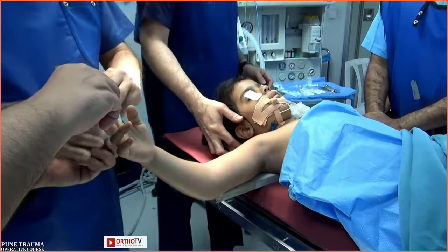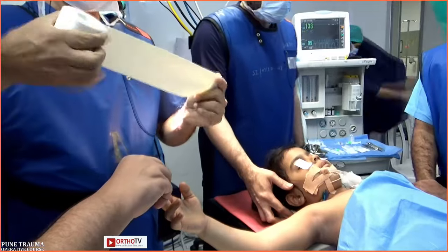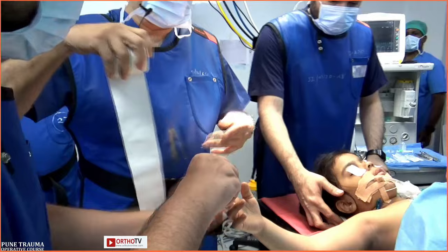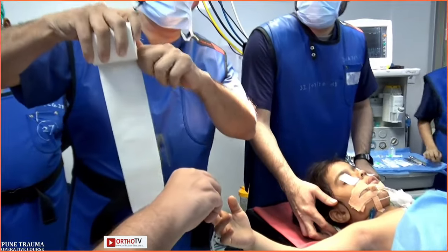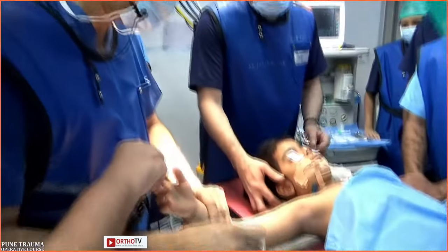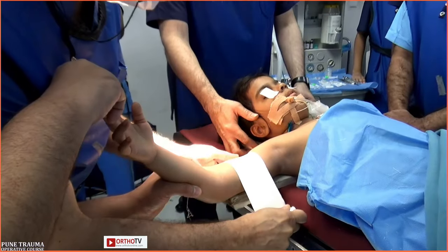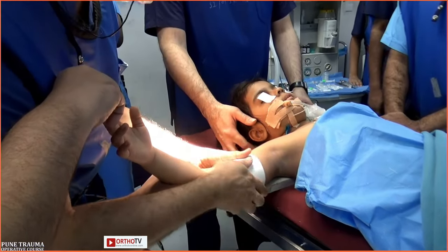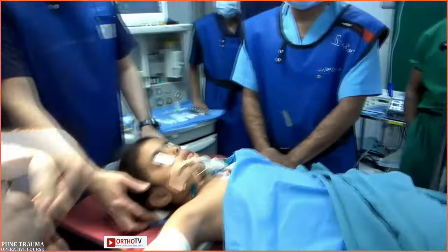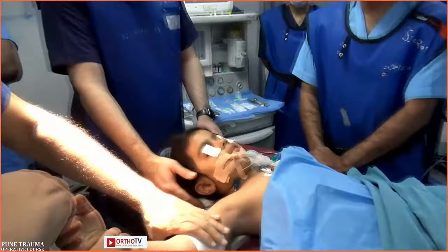Can I have the white tape? Then I just have a simple white sticking plaster in my hand. This is something we were taught as residents, which is very important. This is the biggest innovation in orthopedics: how to tear a white tape by hand. We'll have a workshop next time. Yeah, that is Sion Hospital training. And then I just strap this securely to this area. It's not too firm, it's just secure, and I have somebody holding the board so that it doesn't move. So this is my primary arm board, proximal fragment stabilization.